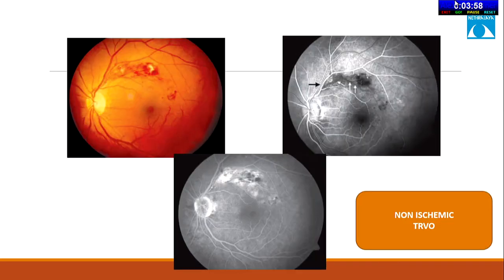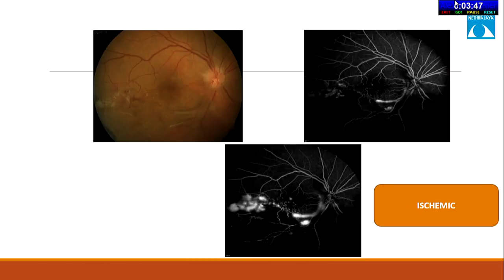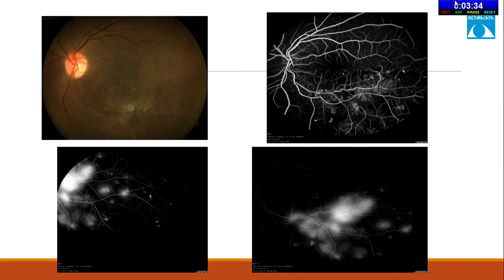And the tributary vein occlusion, which is not affecting the macula. There is blockage of the fluorescence. And here is an ischemic branch retinal vein occlusion, where the inferotemporal vein is occluded with capillary non-perfusion and appearance of NVEs. And there is a profuse leak from the NVEs.